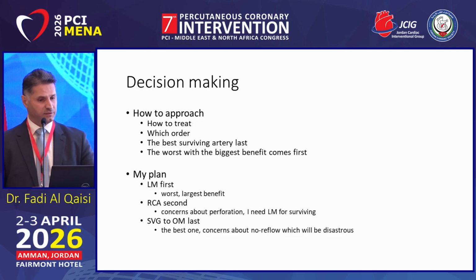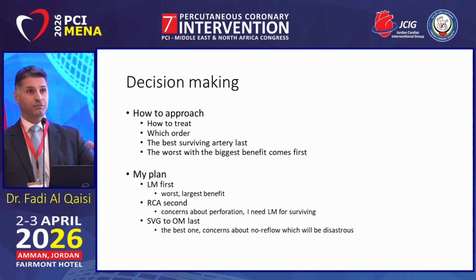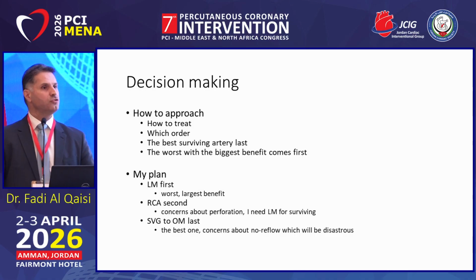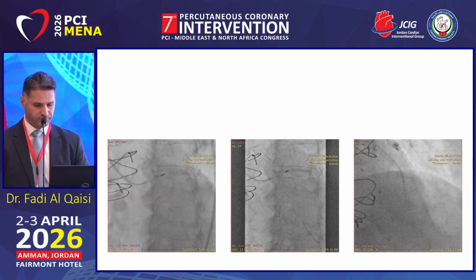Do the RCA second. Why the RCA second? Because it's better than the left main, and it's the highest risk for perforation because of the tortuosity. If I deal with the perforation, I need at least to have a left main to keep the patient alive for the next few minutes while I fix the perforation. And the SVG to the OM last, because it's the highest risk for no reflow, and if that is gone, the patient is dead. So, this was my plan.